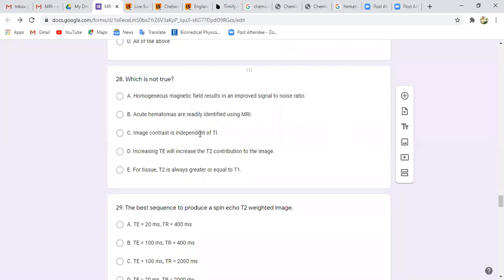However, the statement of image contrast is a blanket statement. Yes, it can have an effect, but is it always going to be dependent on time of inversion? Because not every time we do time of inversion for image contrast in MRI. This should be T1, not TI. Well, it's TI that is there. Okay, T1. Let's base it on T1.